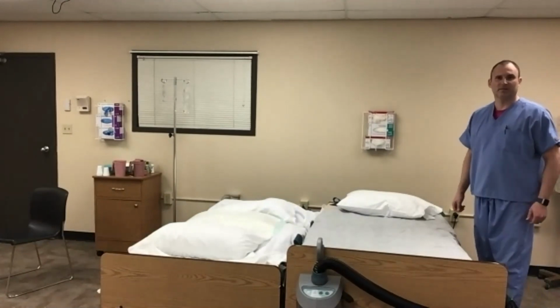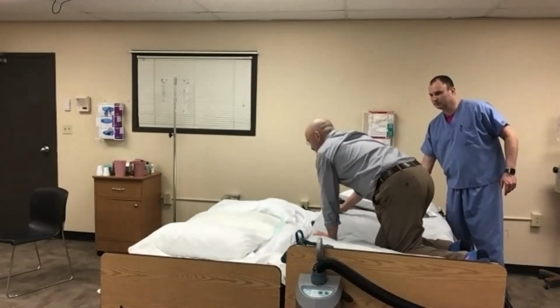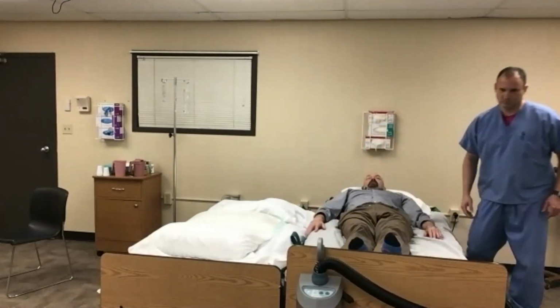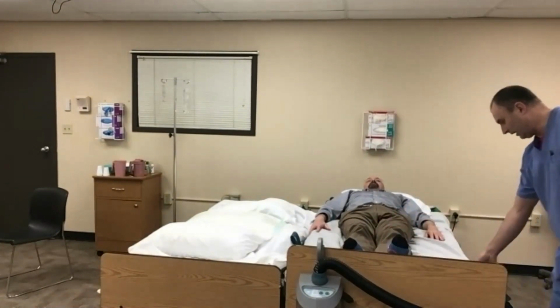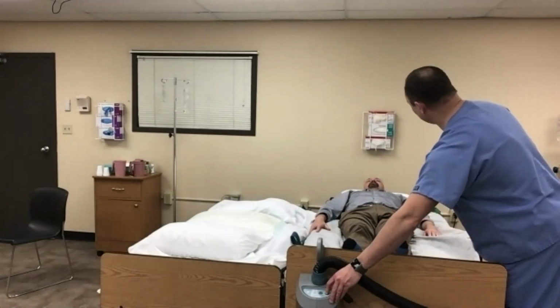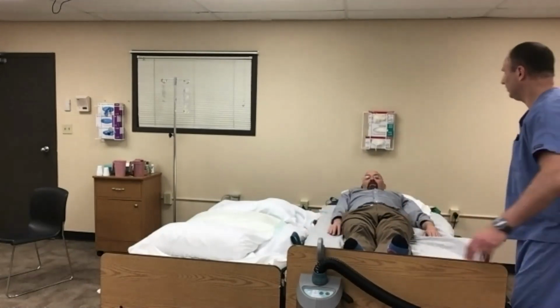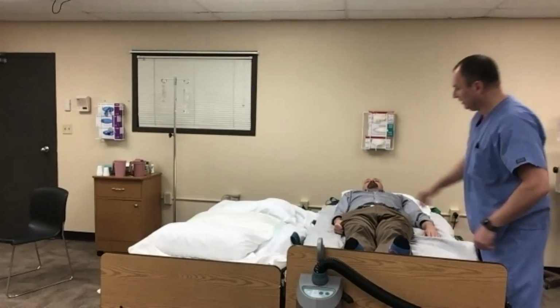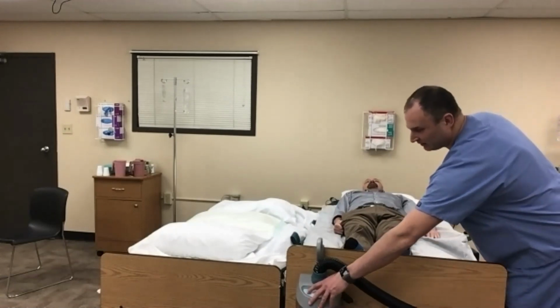For somebody of my size and my weight, you'd have somebody on this side, somebody on that side, and somebody controlling the airway. At least 3 people, and then somebody else would be managing the button. So I always have a person holding on, because we're slippery. You're going to tuck your arm. I'll tuck my arm. Consider the pillowcase, it would be on his inside right arm here if we were to tuck that, but since he's able-bodied, he can tuck his own.